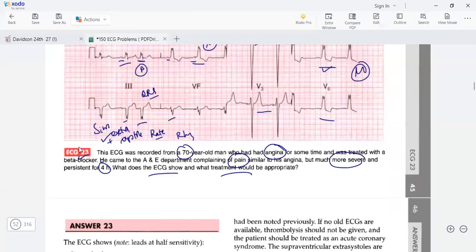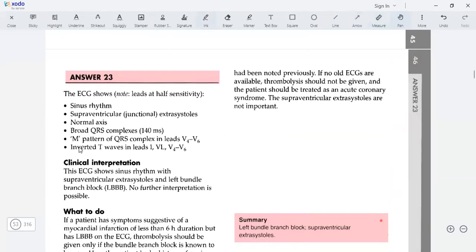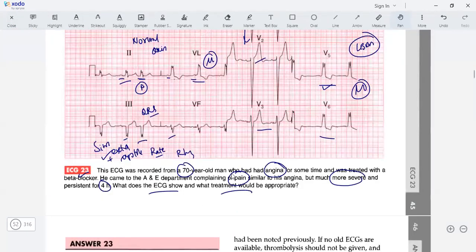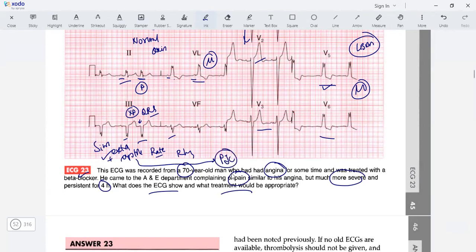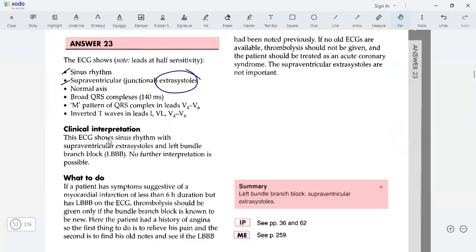Let's see what the assessment says. The book confirms sinus rhythm with extra systoles. These extra systoles have no P wave, so they are junctional extra systoles or premature junctional complexes. Whenever you have a P in front of the extra systole, it's atrial. Without a P, it's junctional. The broad QRS complex with M pattern indicates left bundle branch block. So we have LBBB and junctional extra systole, or supraventricular extra systole.